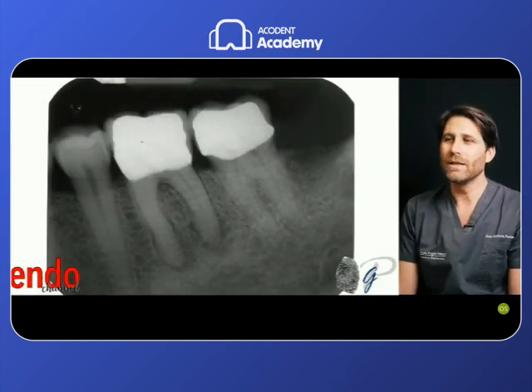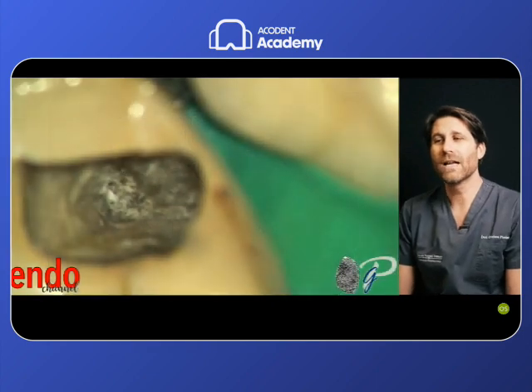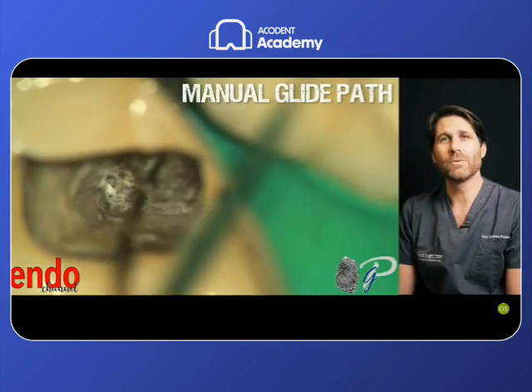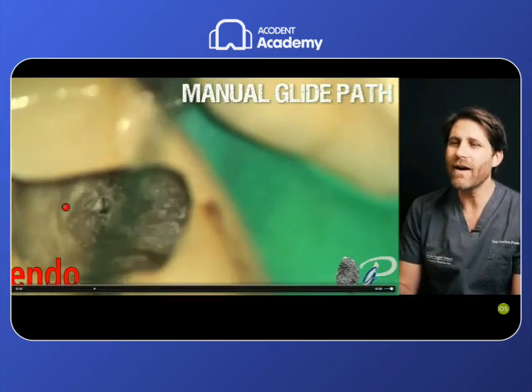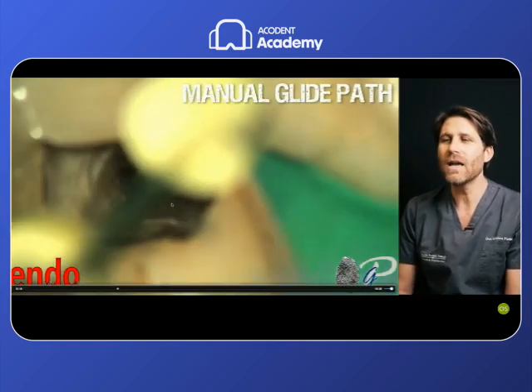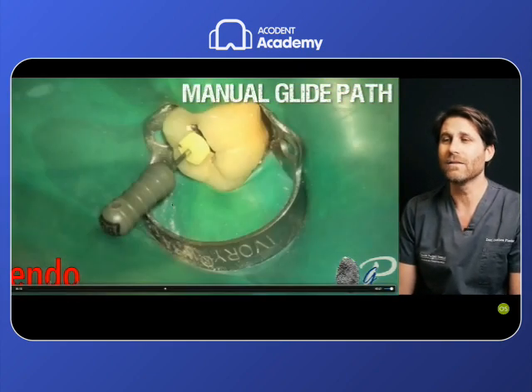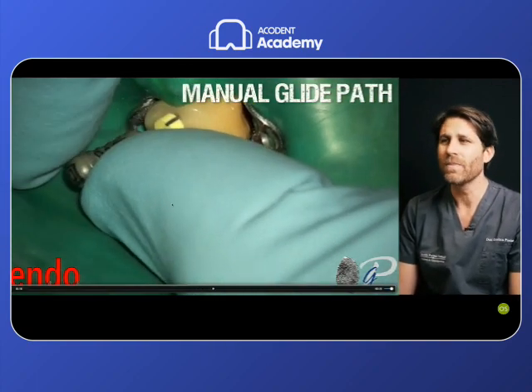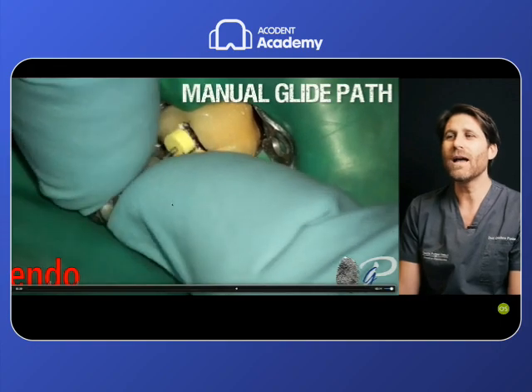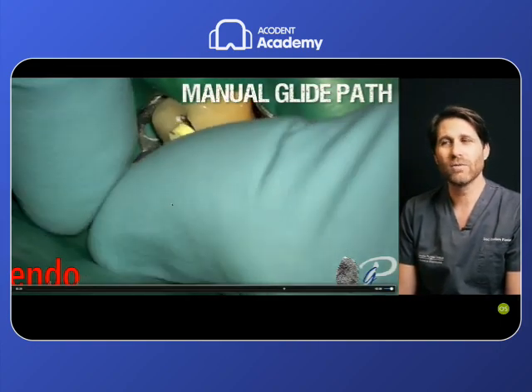For example, in this first lower molar, passing through the crown, removing the calcification of the pulp chamber, as we have seen in the orifice location phase, and as soon as we have identified the orifice location, in this case, I started with the size 8 stainless steel file to establish the scouting and to study the root canal anatomy. I studied the root canal anatomy and I reached the working length with this file, working length controlled with the apex locator.